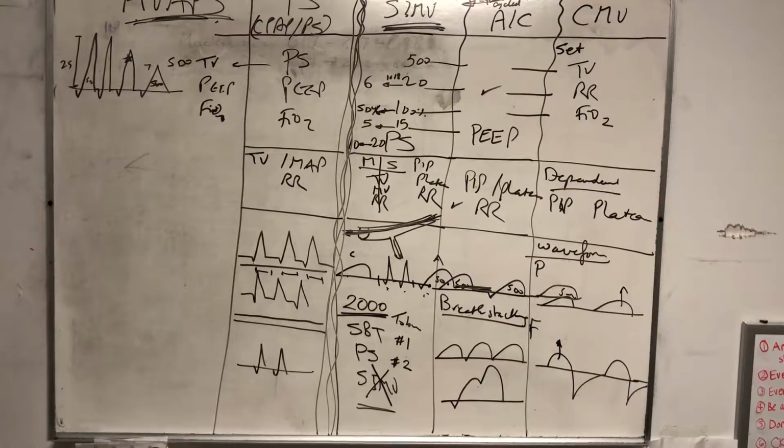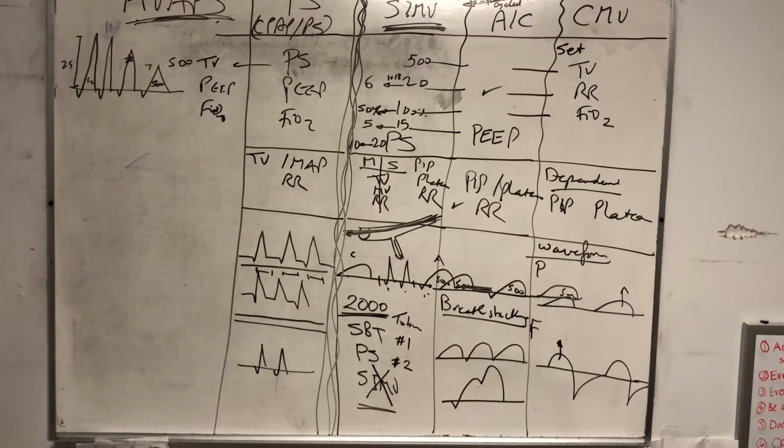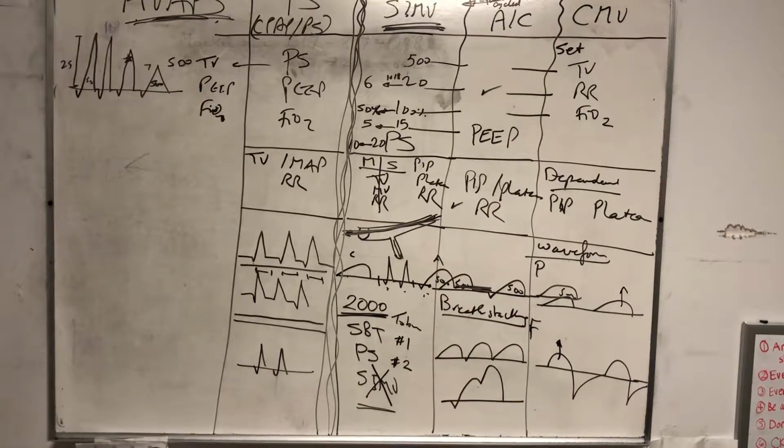You just set it and forget it. You don't need intensivists. And if you can invent an arm that goes in and pulls the endotracheal tube, then you're golden. You don't need anybody. But see, that's the mode of ventilation. It's actually more comfortable, even more comfortable than this for the patients, and the patients will require much less sedation.